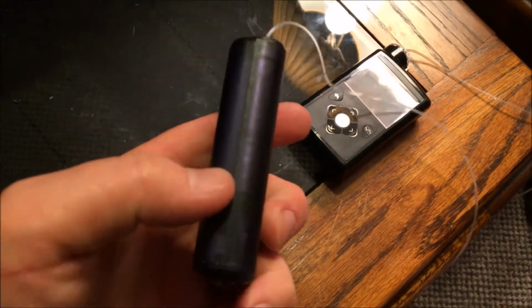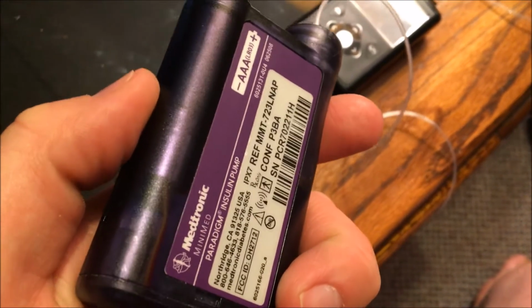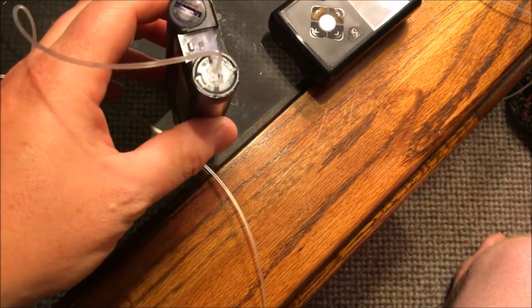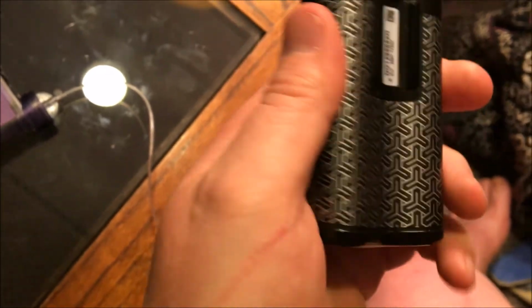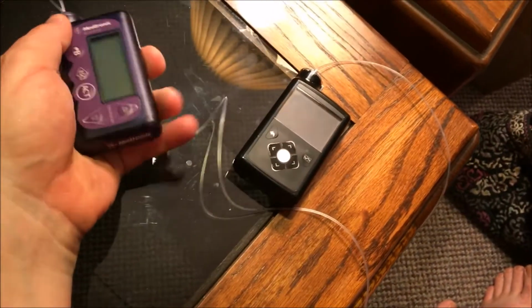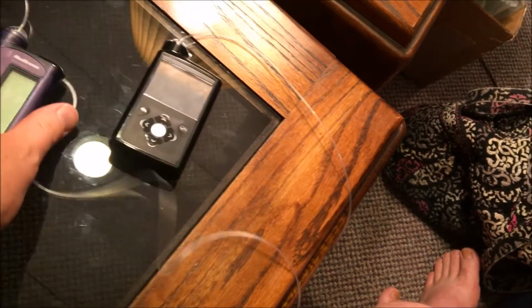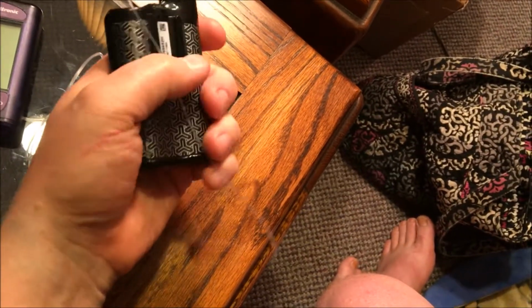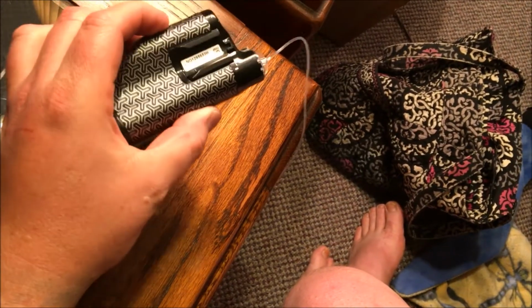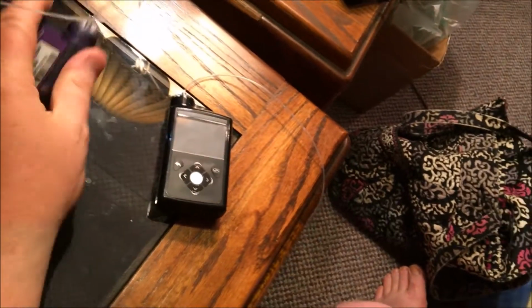Now, one of the other things I kind of miss is you can see that the plastic on here, it's somewhat textured, almost like little sands. It comes off with that textured feel as possibly being more durable than the smooth. But you know, I keep feeling around, and at first I thought that this one was heavier duty, but I'm starting to think the more and more I look at it, I think they're fairly similar. I do like the textured feel to this, though. It does feel a little bit easier to grasp, because this is almost slippery, especially with this sticker on the back. But even without, it's going to be that way. This seems to have a better grip. So I do miss that.